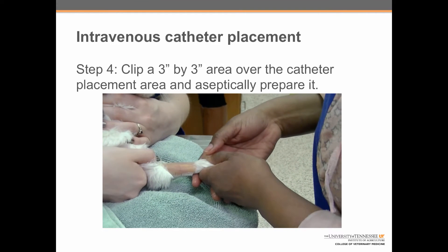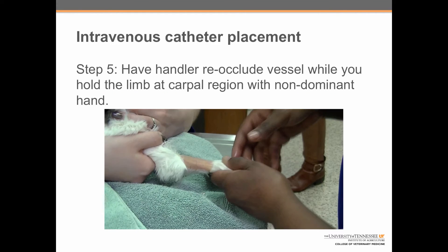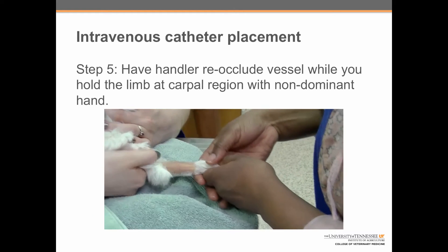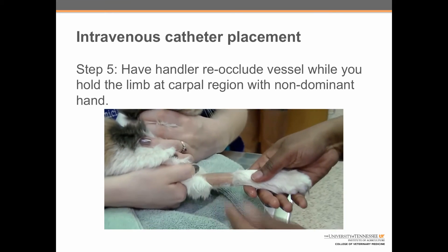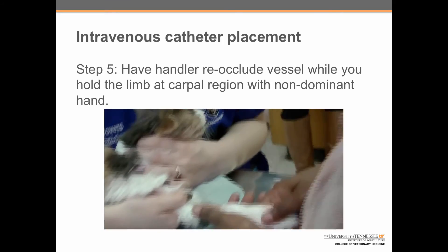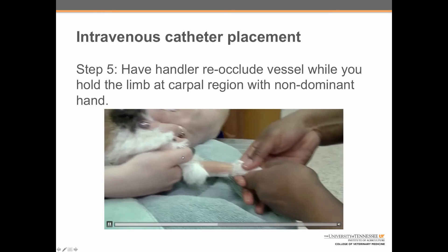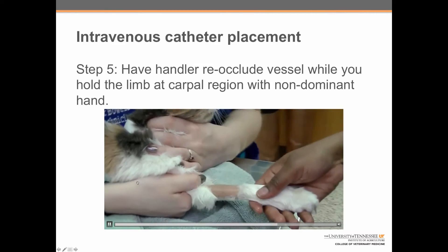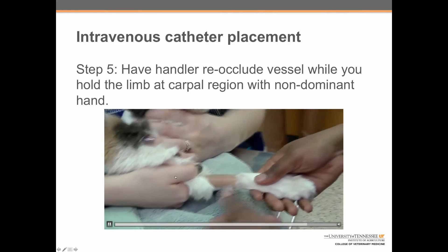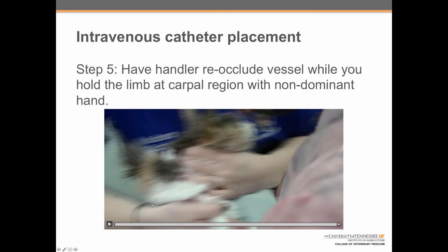We leave the site time to dry. Step 5: have the handler re-occlude the vessel while holding the limb at the carpal region with the non-dominant hand. Here Shanna is getting a good grip on the limb, making sure her hands are clean and dry, while the handler occludes the vessel again by wrapping her thumb across the inside of the elbow and wrapping outward to bring the vessel up into a stabilized position on top of the leg.